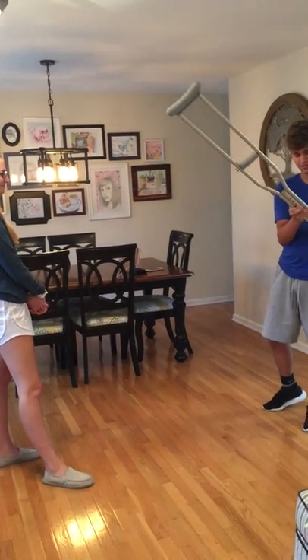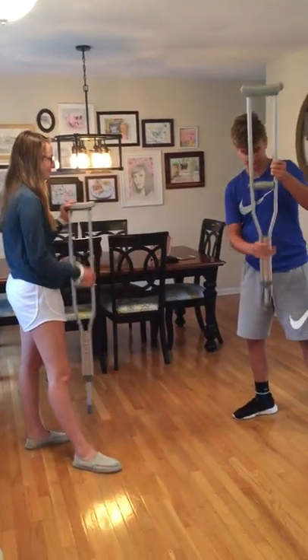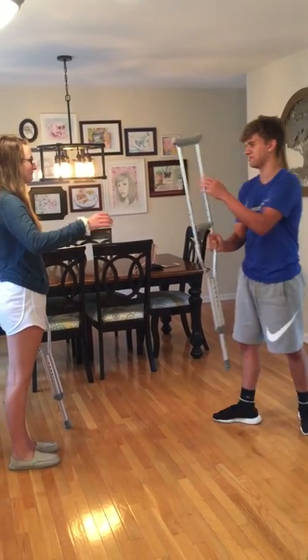Alright, let me get these fixed up at 5'7" for you real quick. There's that one for you. There's that one for you.